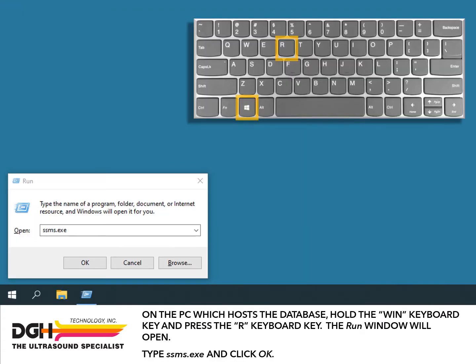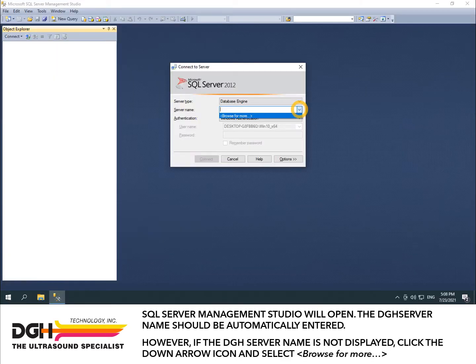On the PC which hosts the database, hold the Win keyboard key and press the R keyboard key. The Run window will open. Type ssms.exe and click OK. SQL Server Management Studio will open. The DGH server name should be automatically entered.